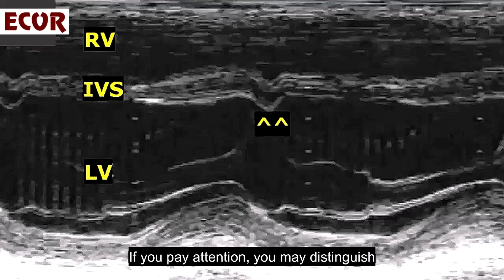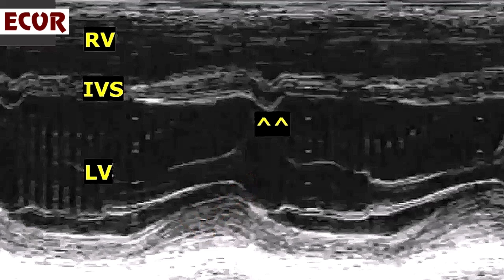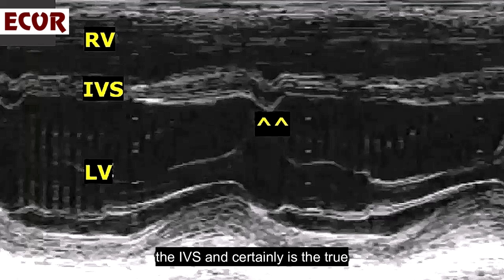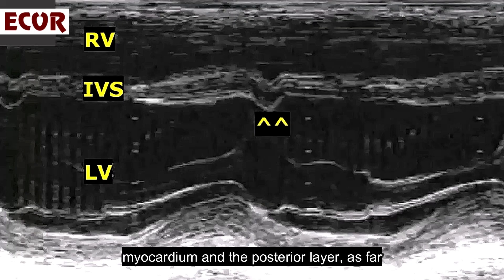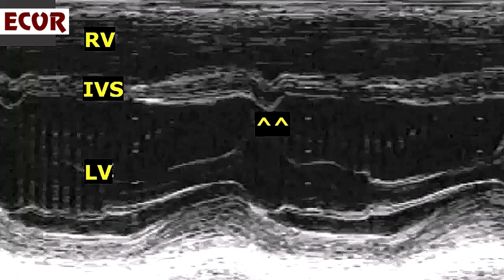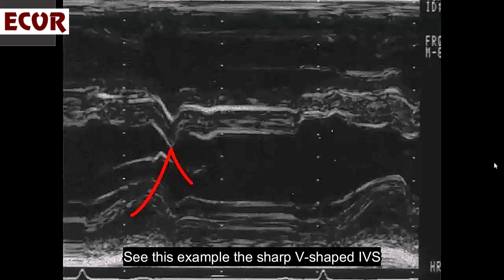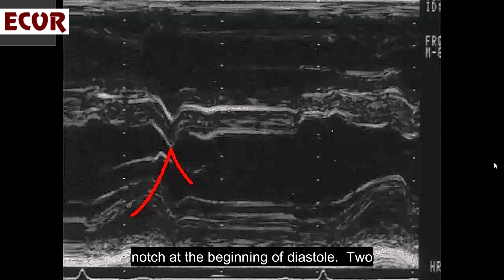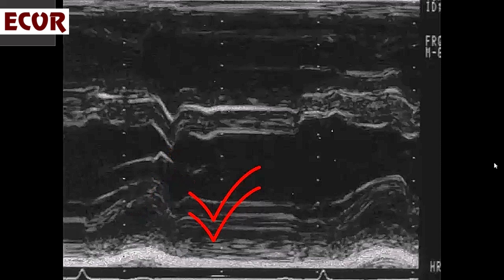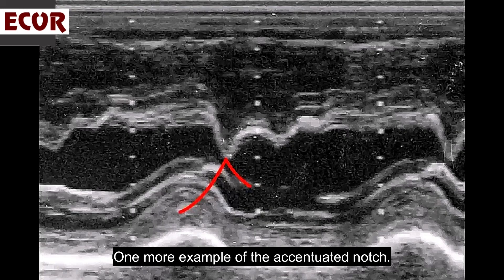If you pay attention, you may distinguish two layers of slightly different echogenicity in the posterior wall. The anterior layer has the same thickness as the IVS and certainly is the true myocardium, and the posterior layer, as far as the pericardial reflection, is the thick pericardium. See this example: the sharp V-shaped IVS notch at the beginning of diastole and two layers of slightly different echogenicity in the posterior wall. One more example of the accentuated notch.